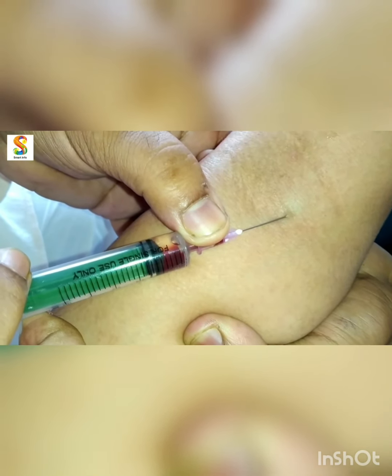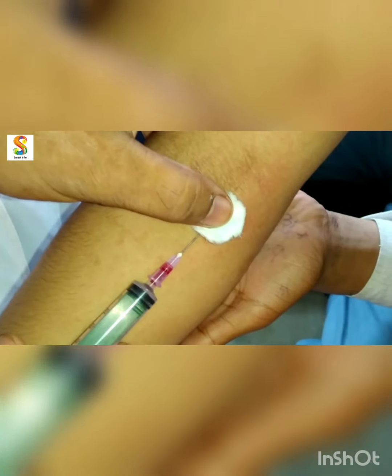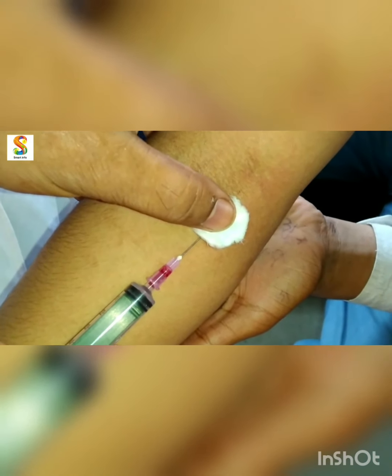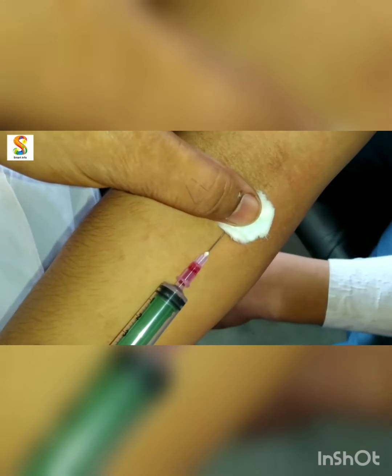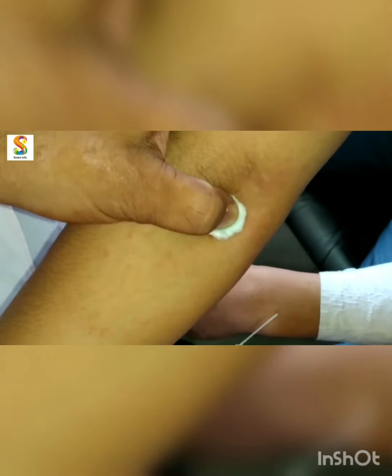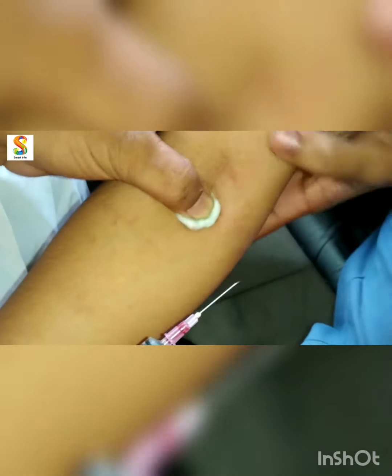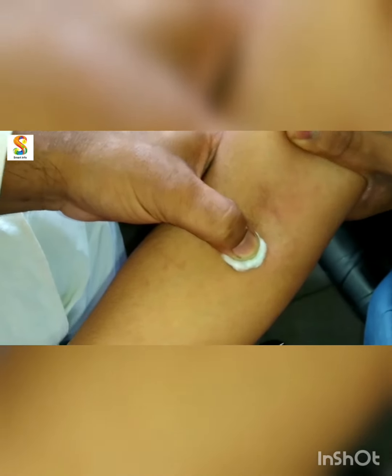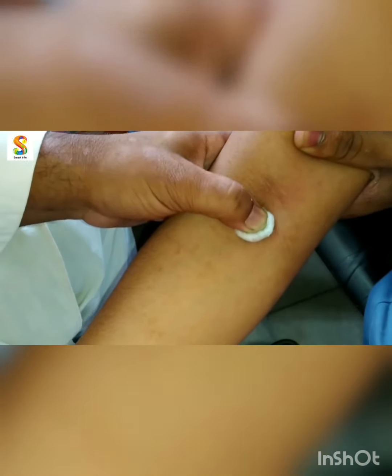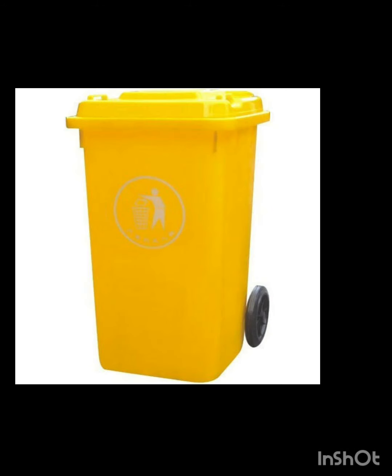Once you are done with that, put a cotton on the needle site, and then remove the injection slowly, and then exert pressure on the site where you have injected, so as to stop the bleeding. After that, you can use a band-aid also. Then you can throw the syringe and everything used into the medical dustbin, so as to make sure that no one can reuse your used injection.